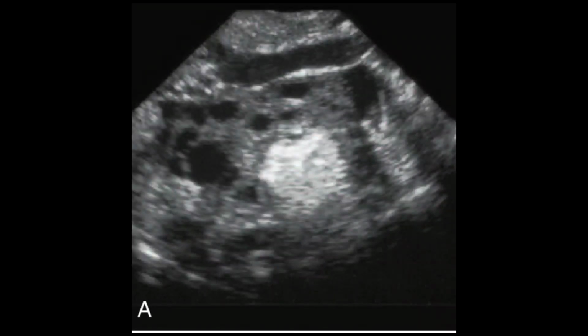You may call it a nodule, a small mass, or a lesion, whatever you prefer. You can apply all these terms, but this is a specific characteristic feature of cystic teratoma. This is also called dermoid. Normally we call it a dermoid. So this dermoid within the ovary is clearly visible, and you can appreciate it on the transvaginal scan.